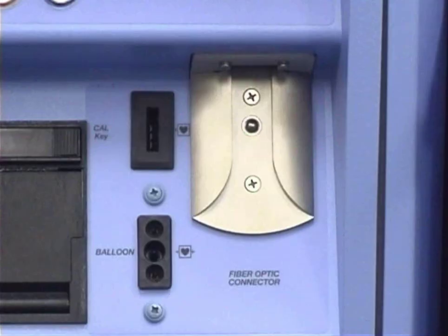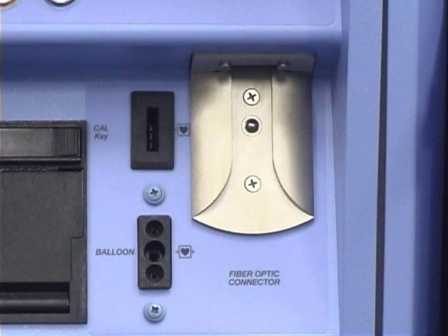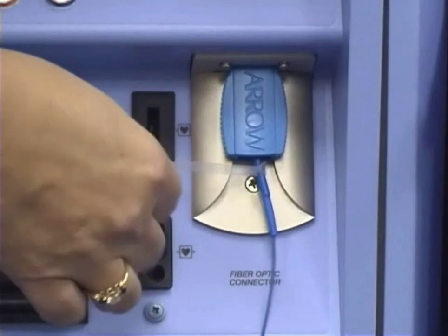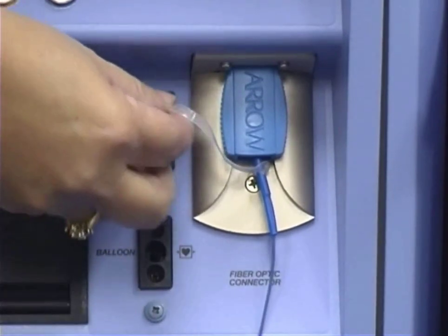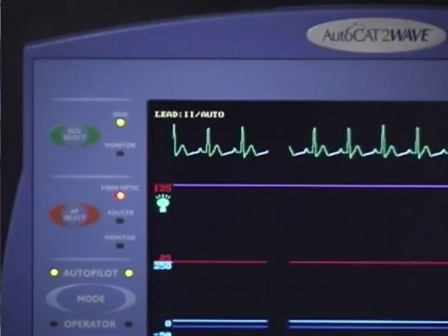The fiber optic arterial pressure connection is exclusive to the AutoCAT-2 Wave. This connection must be made to the pump before the IAB catheter is inserted into the patient for automatic zeroing of the pressure to occur. As soon as the balloon catheter tray is opened, the blue fiber optic connector and the CAL key should be passed off the sterile field and connected to the pump. In either order, the blue fiber optic connector should be gently slid up until a click is heard, and the CAL key should be inserted into the CAL key slot. Either direction on the CAL key is fine. The fiber optic sensor is automatically zeroed shortly after both connections are made.